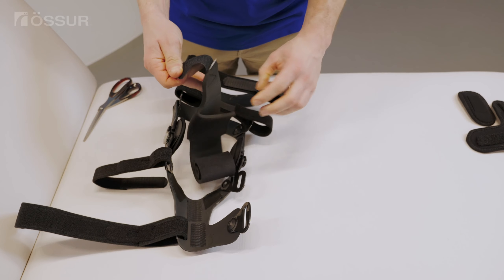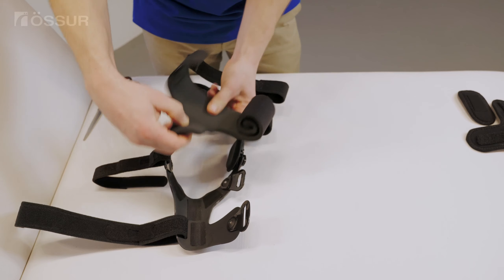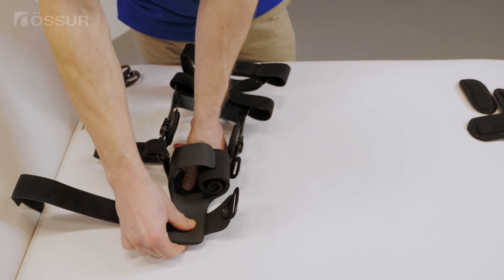Unfold the AMS wrap. Install the wrap onto the lower frame. Apply the brace to your leg and fasten the wrap.